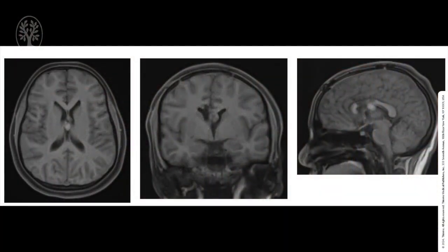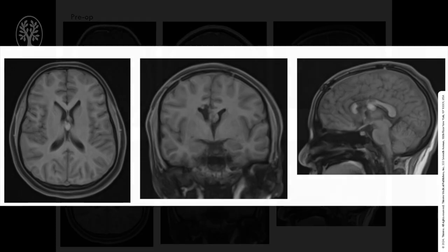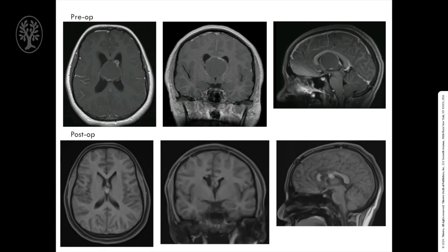Postoperative MRI showed her anterior third callosotomy with excellent debulking of her colloid cyst with a small posterior inferior remnant adherent to the velum interpositum. The patient had complete resolution of her hydrocephalus, and follow-up imaging has revealed no recurrence of the cyst.